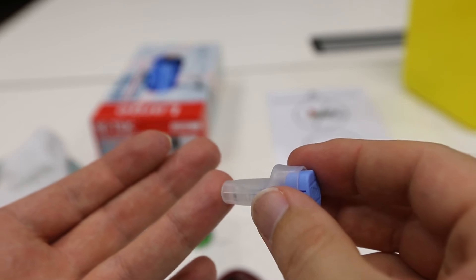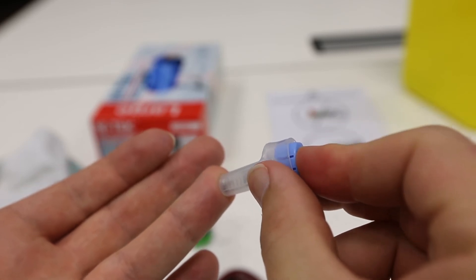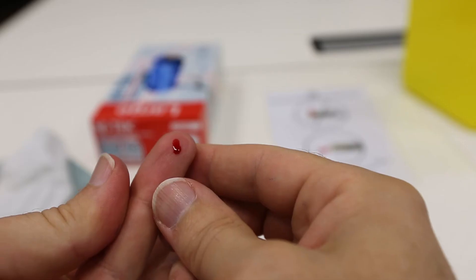To use the lancet, press it gently against your skin and press the button. Squeezing your finger gently will encourage the blood to come to the surface.